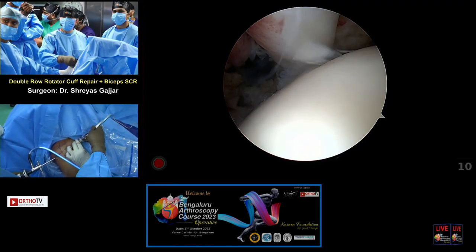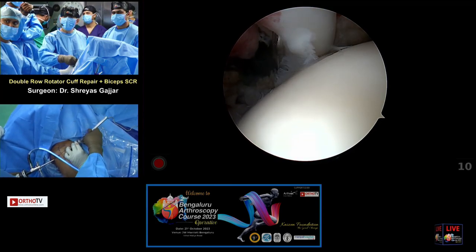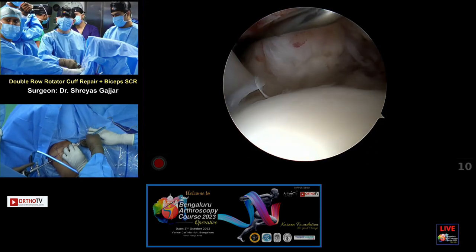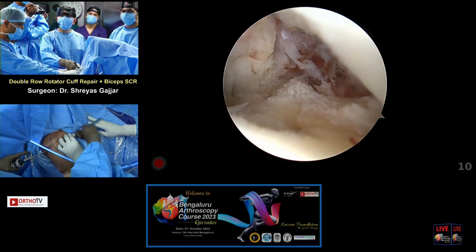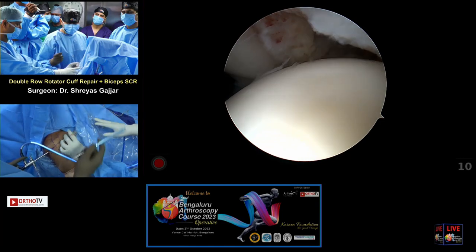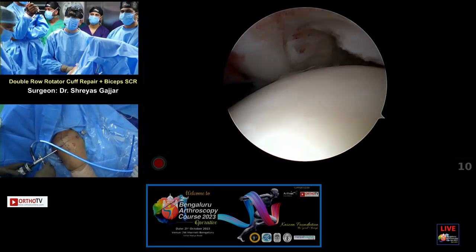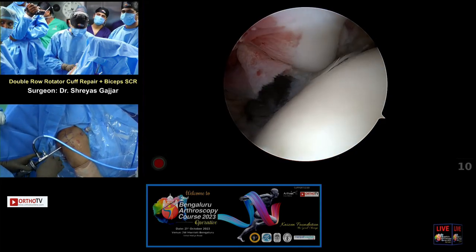Cannula, please. You can see that this is a tear. So we are going to go to the acromial side. I've just done a preparation of the tuberosity with burring. It's important to be judicious to not take away the bone because it's a good purchase. So that's the vision of the tear. I'll go to the acromial side now.